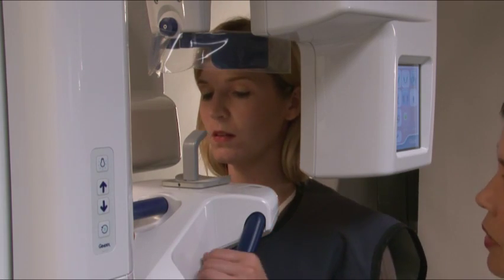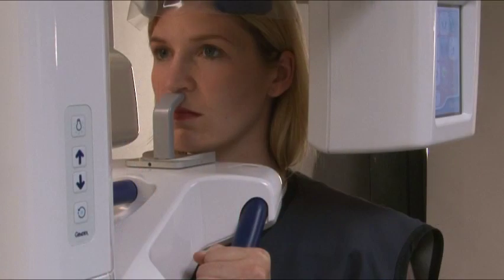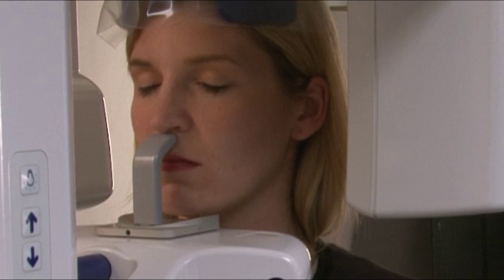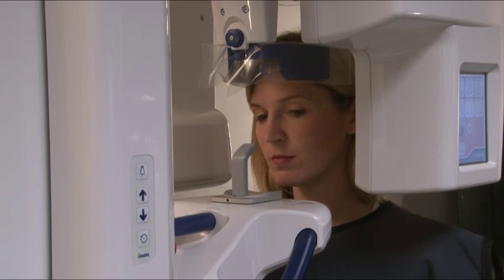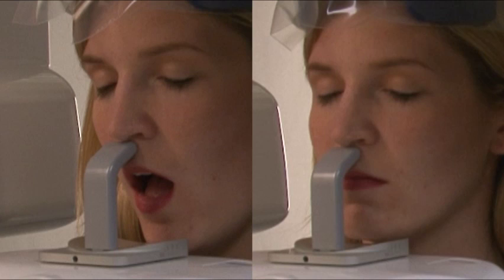Press the up and down keys to adjust the height of the chin rest so that it is slightly higher than the patient's chin. For open TMJ, ask the patient to open their mouth as they approach the unit. For closed TMJ, the patient should approach with their mouth closed and teeth clenched together. Ask the patient to step into the unit, grab hold of the handles, and press their top lip against the top of the nose support.